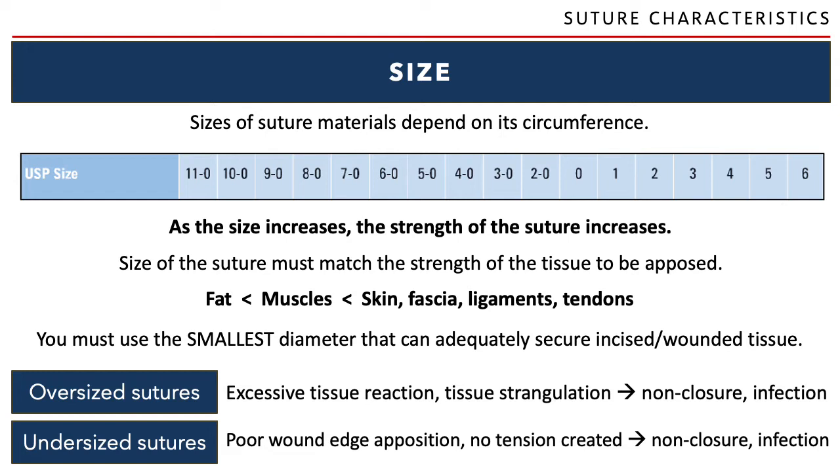All right. So the way ng pagtimpla ng sutures is, again, I started this way. My professor said, always use a 3/0, always use a 3/0. And then I encountered a dog, which I thought a 3/0 would do. Came back after 3 days, there's a part of the wound that is open because I used a suture that is too small. So again, it's based on experience. I usually use 3-0 for the abdomen, the peritoneum, but when I go outside for the skin, I use a 2-0, right? Again, there's no wrong thing here. It's just your surgical judgment, which will be tested, right?